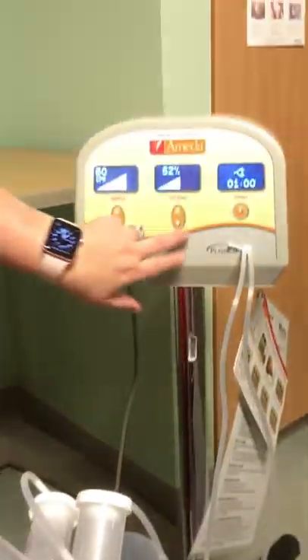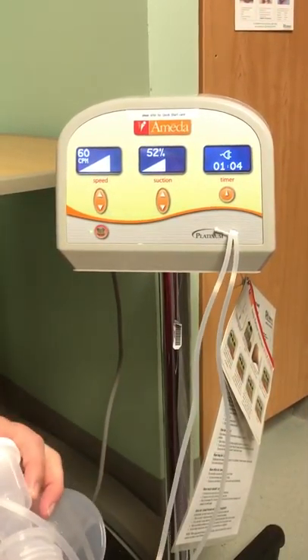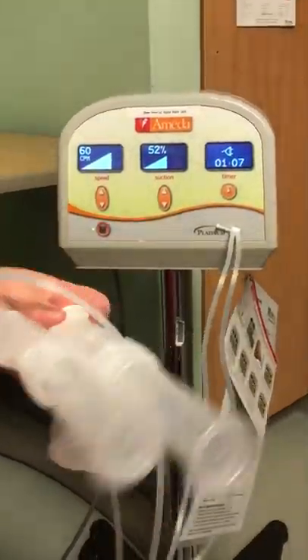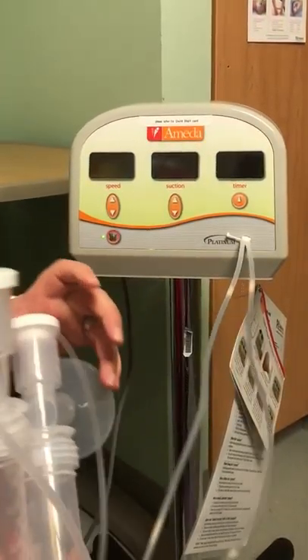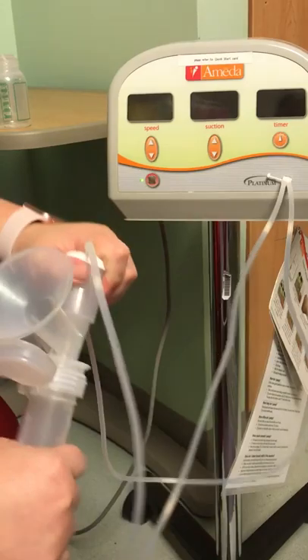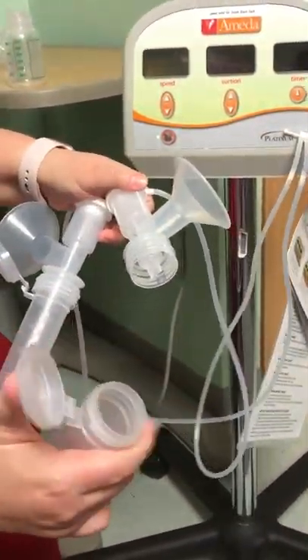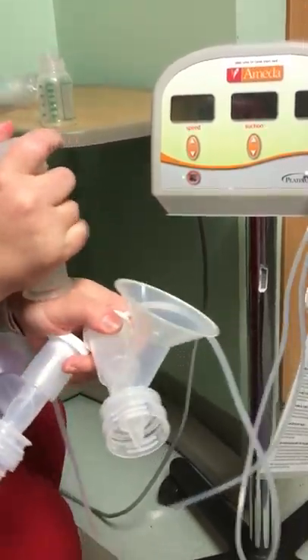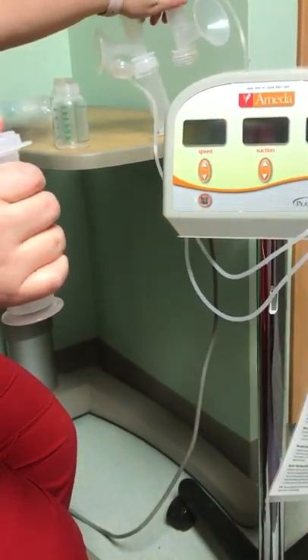The mom would continue at this speed for 15 to 20 minutes, usually until her breasts are empty. Once she's done, turn the power off. Disconnect the Snappies, close the lids, label them per Choa's policies, and then store them either in the breast milk freezer or fridge depending on whether the milk will be used soon or not.